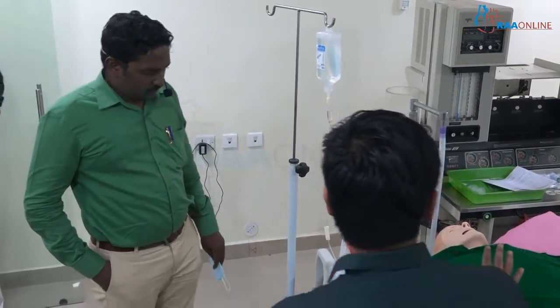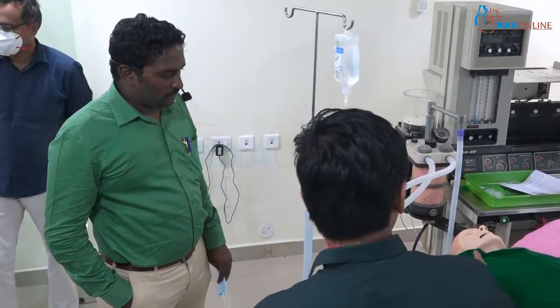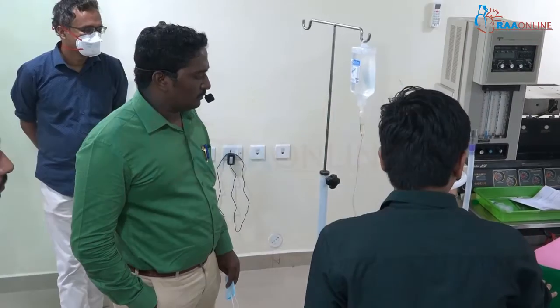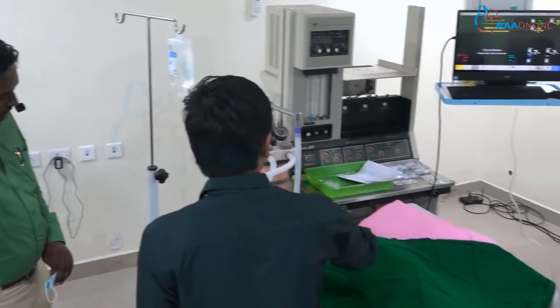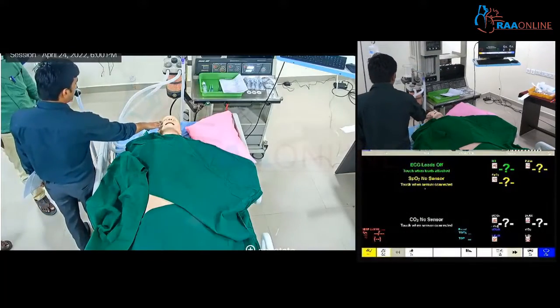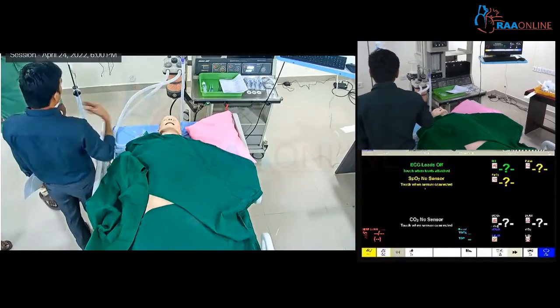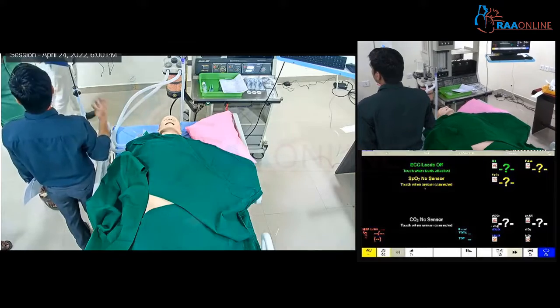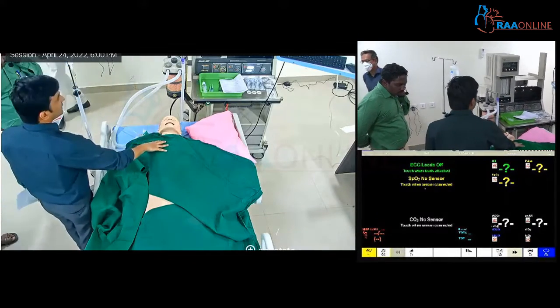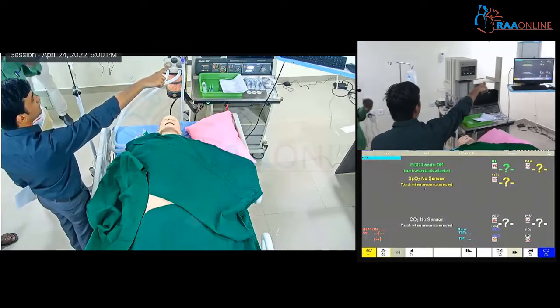So the SimMan has some features. You can see some breathing movements, respiration, and eye opening can be there. The patient cannot verbalize, but we can give the patient a voice. These are the things which can be there. It can also show some monitors.